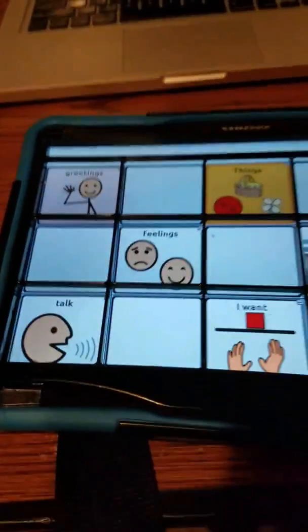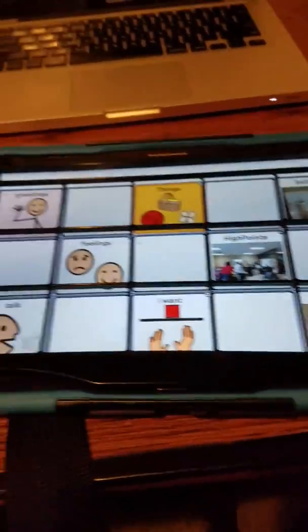Okay, this is going to be my review of a speech generating device. This is Michael Hickey for SPCE 636. I have a brother with an autism diagnosis who has one of these. This is a Samsung Nova.